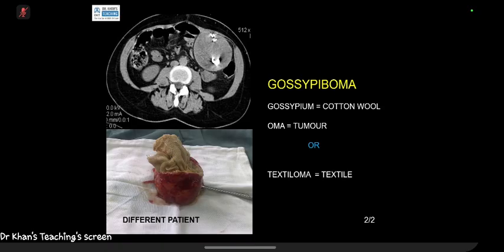No, say again? No, that was a CT. So I've saved it. I've got one in the rectum, post prostatic, for about 35 years. It was there for about 15 years. But one of our consultants, who is a stroke consultant, wrote a case report on this in Croatia, sitting there for 35 years. So what have you learned? These gossypibomas can present acutely, or they can be there historically because they become sort of indolent. And the radiology is horrendous.